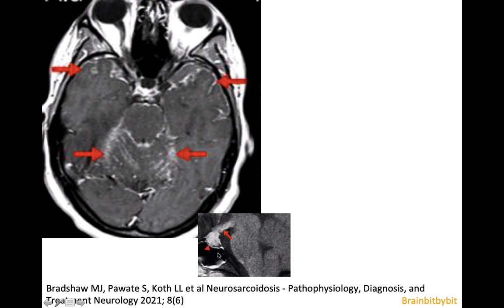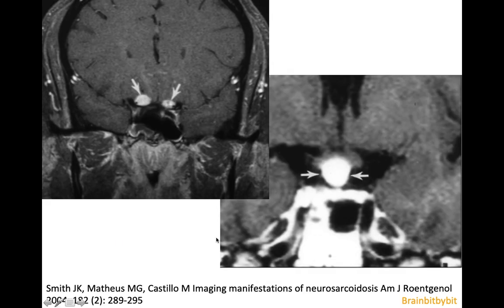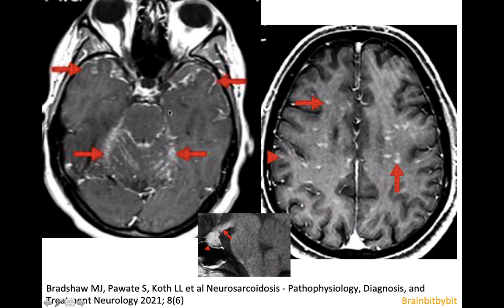Because there's involvement of the basal leptomeninges, you can also see thickening of the pituitary stalk and of the optic nerve, which might be mistaken for meningioma. The basal leptomeningeal enhancement can extend along the perivascular spaces, giving this very typical pattern at the level of the centrum semiovale.